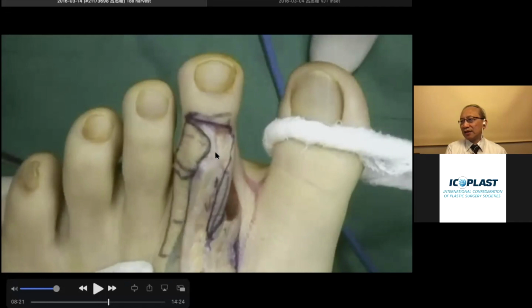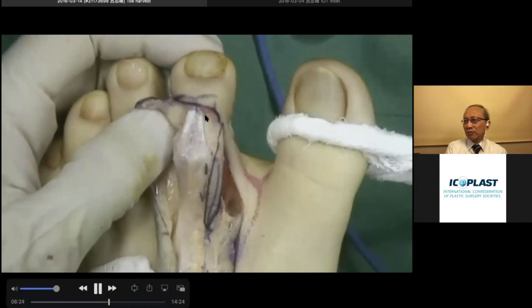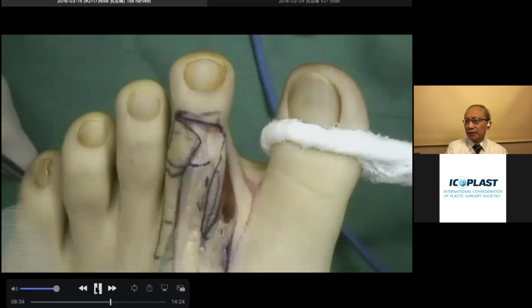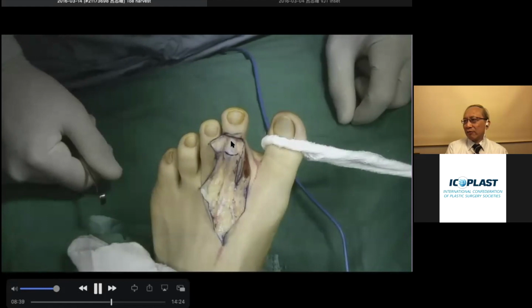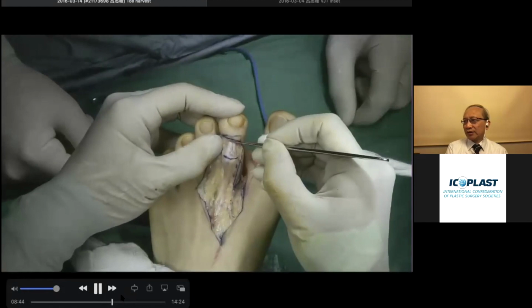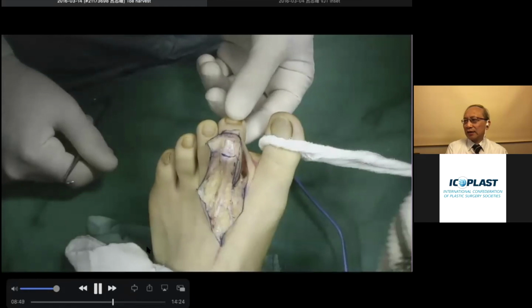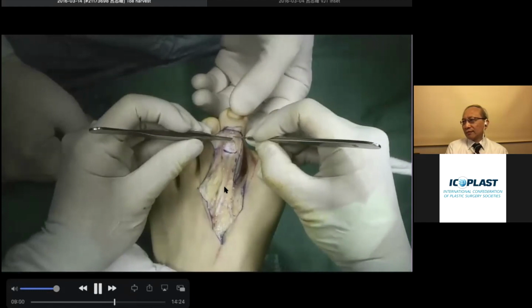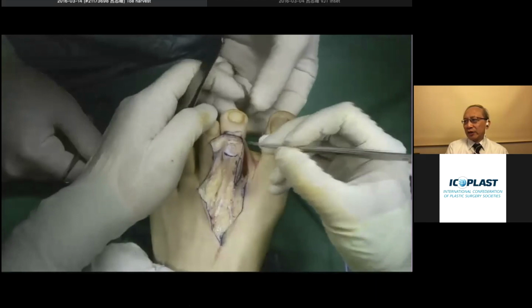And then we turn it back to the supine position and continue the osteotomy and tendon severance. So, marking the PIP joint. In this case I measure about 1 centimeter from the PIP joint, and then I cut nearly at zone one of the extensor tendon. Cut the periosteum a little bit longer here, closer to the DIP joint, and preserve some periosteum for later, when we transfer to the finger joint, for closure on the finger.